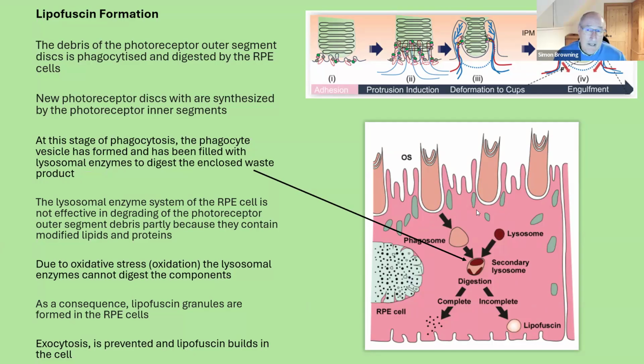Now, if you want me to go into how the oxidation works, we can put a 2-hour lecture together on how that all happens. But do go away and read up on it if you're interested. From the point of view of the sheer practicality of it, what we know is we get lipofuscin formed, and that's what we can use.